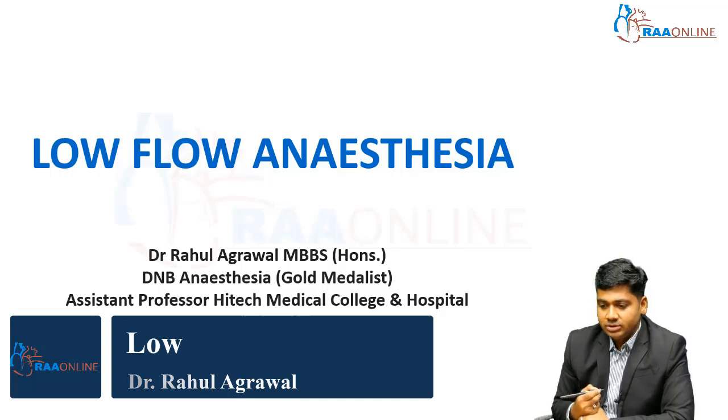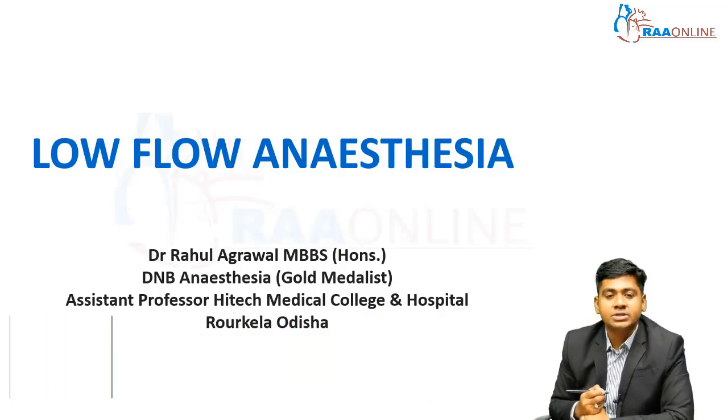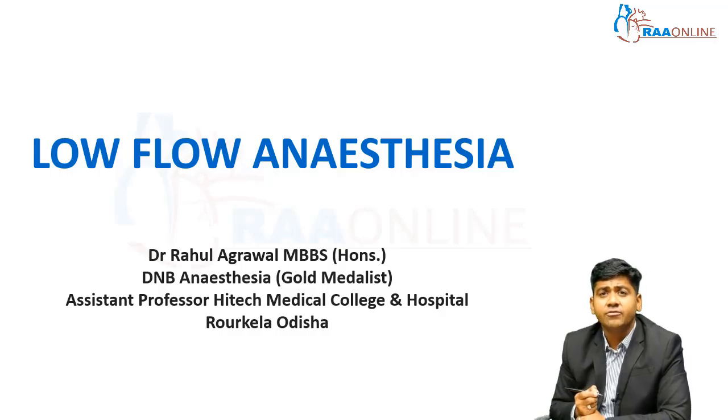Today, we'll discuss the current, modern technology, that is low flow anesthesia. Low flow anesthesia is recently practiced in every OT. Mostly, we are also doing this low flow anesthesia because it has so many advantages. It will lead to a decrease in OT pollution. Also, there will be greater conservation of anesthetic gases.